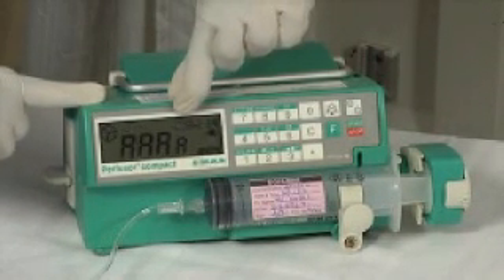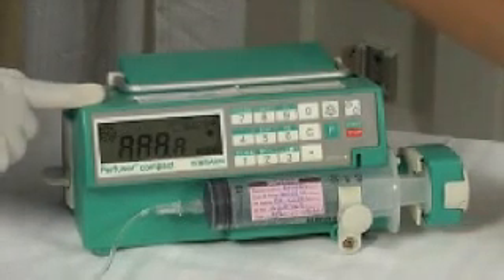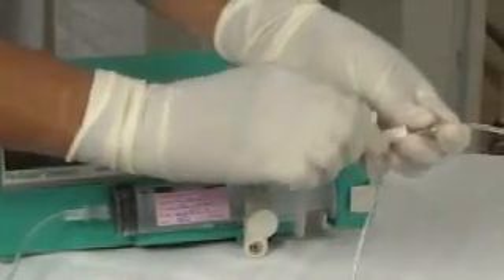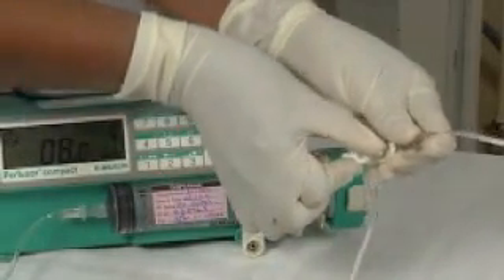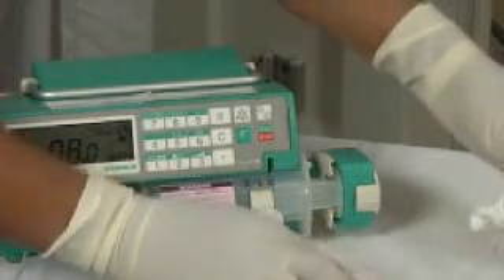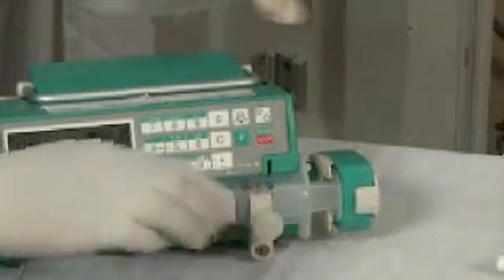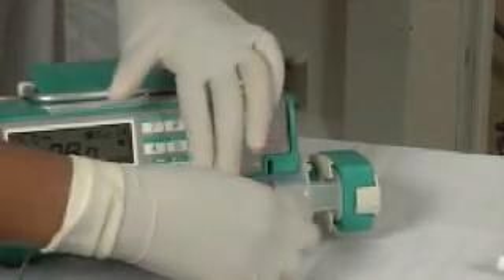Before we change over to the new syringe, we have to stop the three-way valve. To stop the valve, we have to turn its key to the patient side, which will result in the interruption of the flow. Now close the pipe to get the flat side on the side where the infusion tube is connected, so that the fluid is blocked.